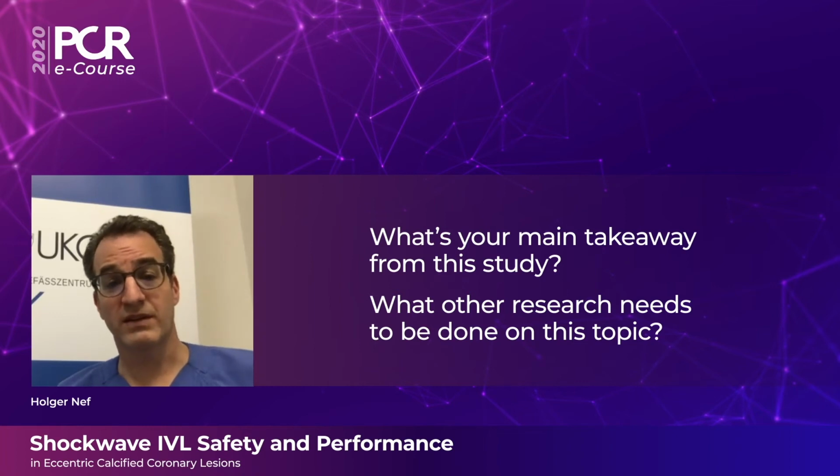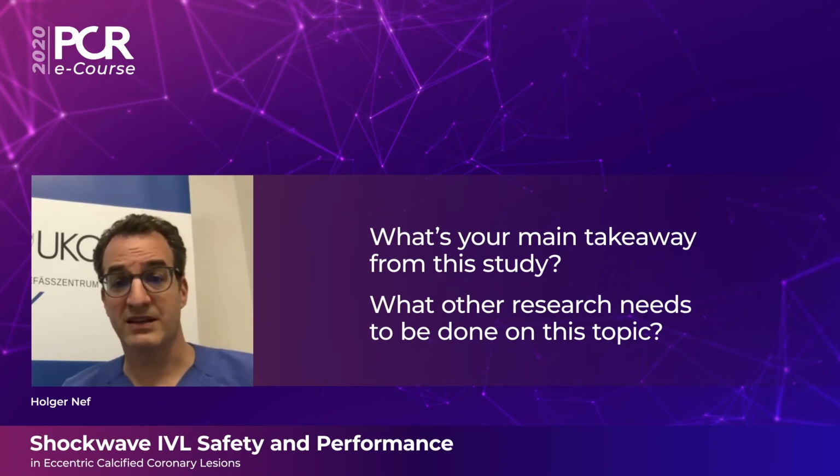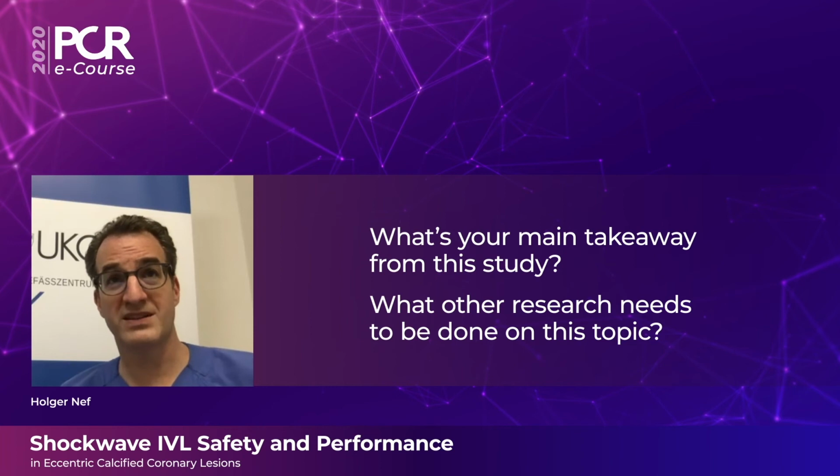Well, given the angiographic limitations in determining the exact arc of calcium within the lesions, we know that we need further insights from the OCT and the IVUS just to have more impression of what the effect of intravascular lithotripsy is in these concentric versus eccentric lesions. But this will come from the upcoming Disrupt CAD clinical program trials.